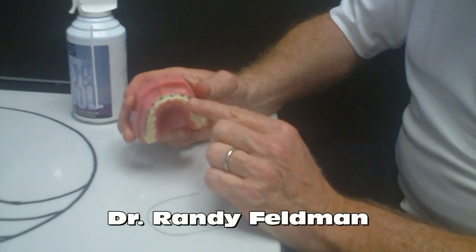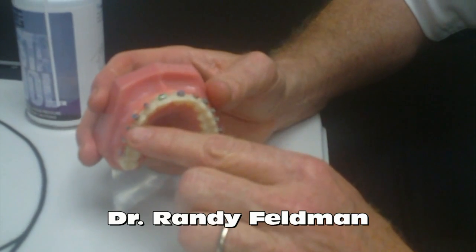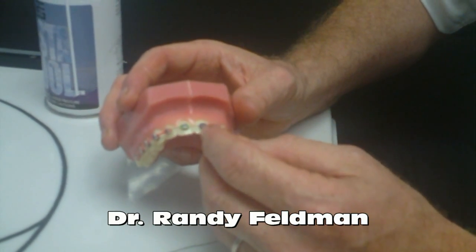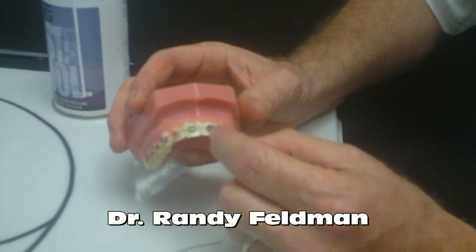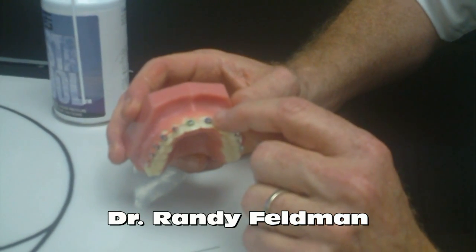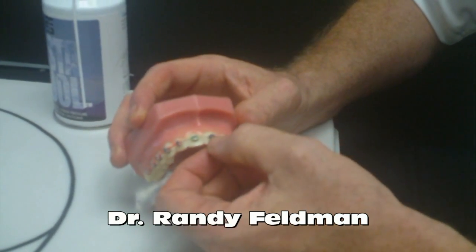We actually glue or affix little tiny metal or ceramic brackets onto the teeth — that's what you see right here. What you also see are these little colored elastics, which are called ligatures. Ligatures are little round donuts that fit over the metal clip, and that's how the wire is ligated or tied in to the metal bracket.